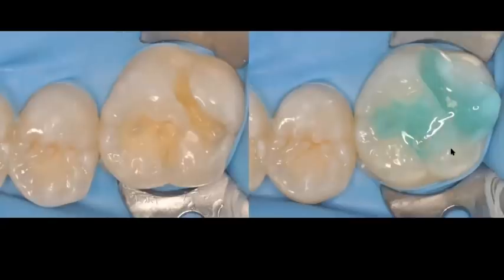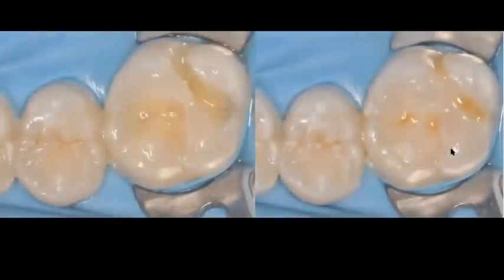We're going to rinse the acid. We're going to leave the cavity slightly moist. And in this particular case, we use a 2-bottle adhesive system. So we're using a 4th generation dental adhesive system that has a primer in one bottle and the adhesive in another bottle. And that's what we're going to use for this particular case. You can see now we've created a hybrid layer by combining the primer and the adhesive. Again, we follow the same technique. We eliminate the solvent. We eliminate the excess with a microbrush. We light cure, and then we start layering.